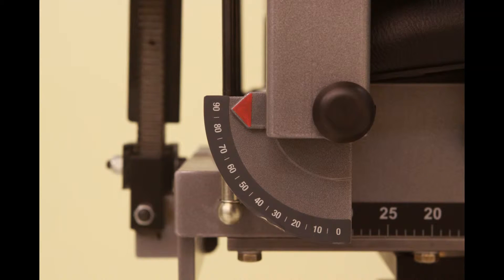If using the chair for stabilization, position to 90 degrees. Ensure both locking handles are pushed down to secure.